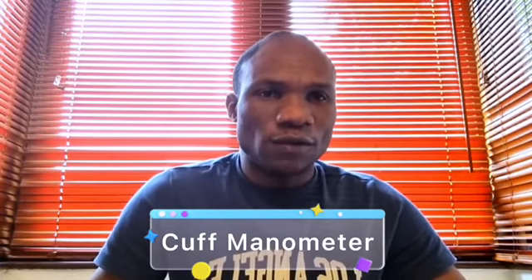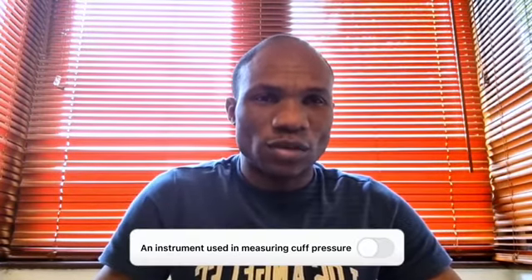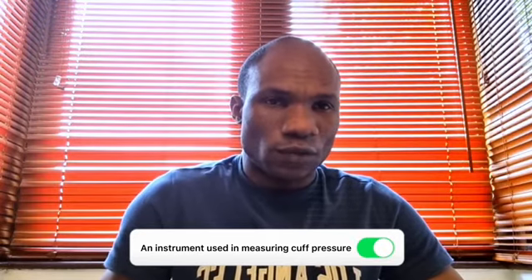And in this video, I want to talk about one of the instruments that we use in the intensive care units, and it is called a cuff manometer. The cuff manometer is an instrument that is used to measure cuff pressure. So very quickly, I'll be discussing briefly what the cuff is and cuff pressure, and then the cuff manometer.